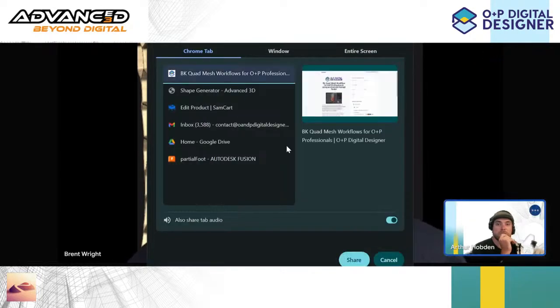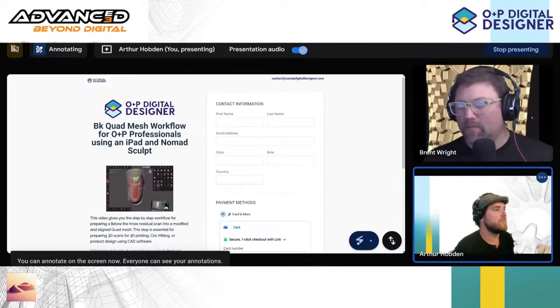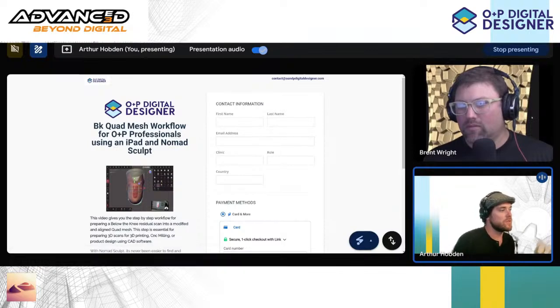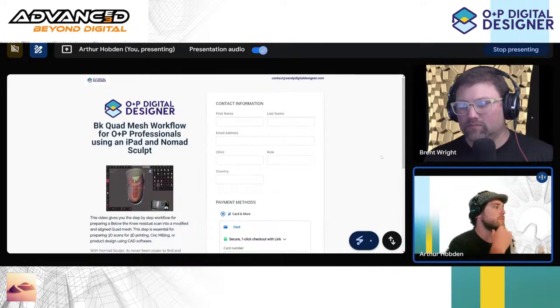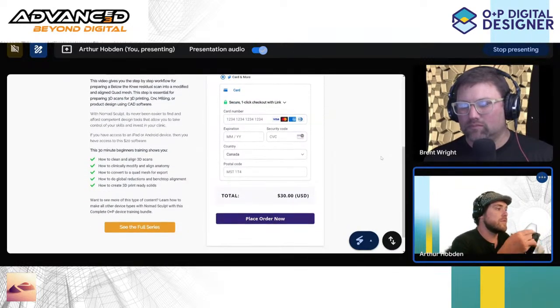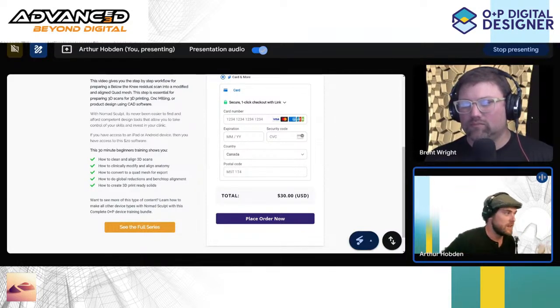That's super cool. Well, hey, in response to that, I've come up with the video series for Nomad Sculpt, and there's a full course including AFOs and residual limb, sound side limb, cosmesis, workflows, and SMOs. But the socket side of the videos I've just separated out for people who want to take advantage of this.